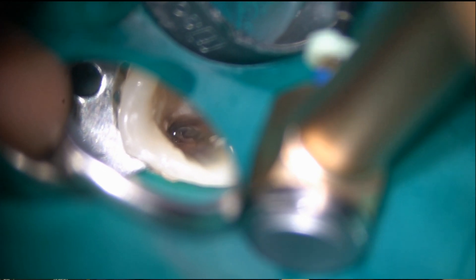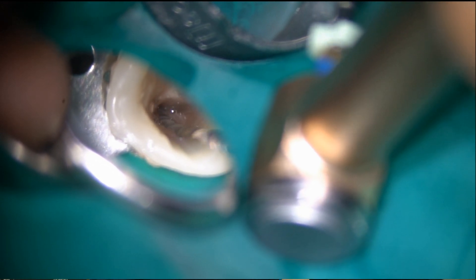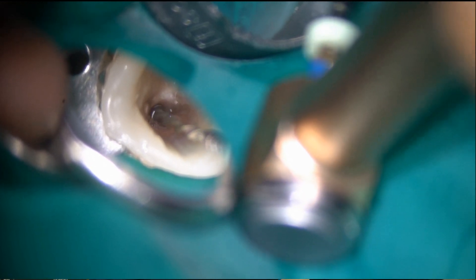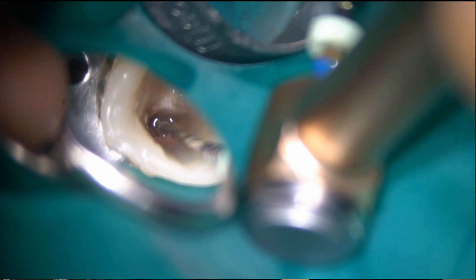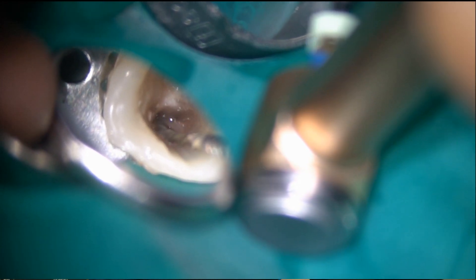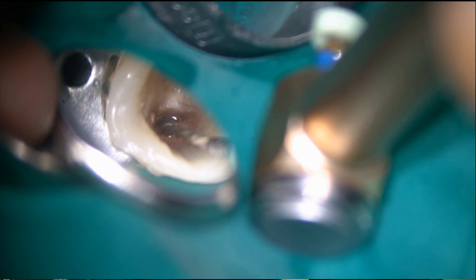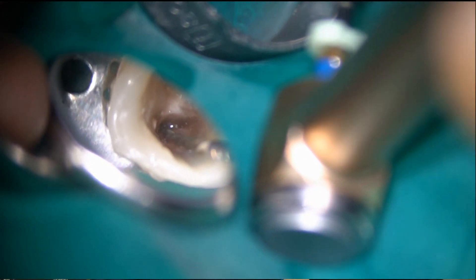I'm using T-Mode: 380 degrees clockwise rotation and 50 degrees counter-clockwise rotation at 150 RPM. This can prevent transportation and also instrument fracture in this reciprocating rotation.